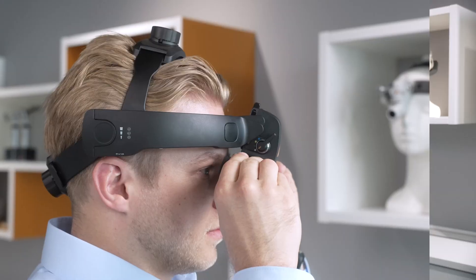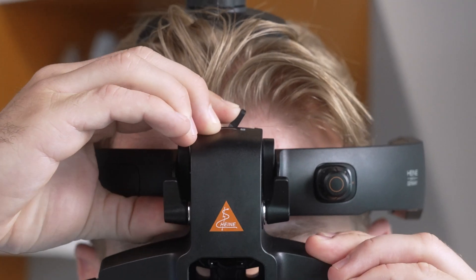Next, bring the optical unit forward, close to your eyes but not touching, and lock it into place with the adjustment lever.